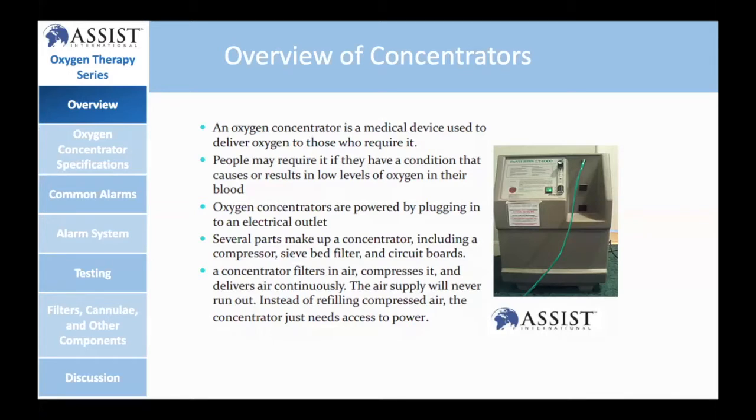Someone may have a condition that results in, for example, a low level of oxygen in the blood, and in that case, of course, they need medical grade purified oxygen, something above 90, 93, 94, 95%. So an oxygen concentrator, in short, provides purified oxygen to someone who needs it.